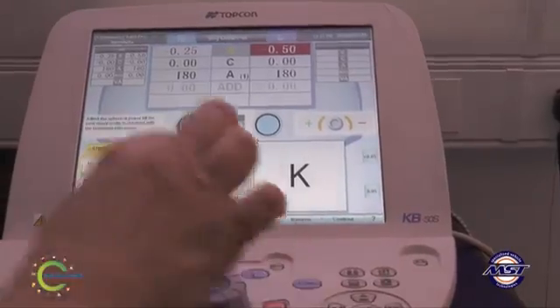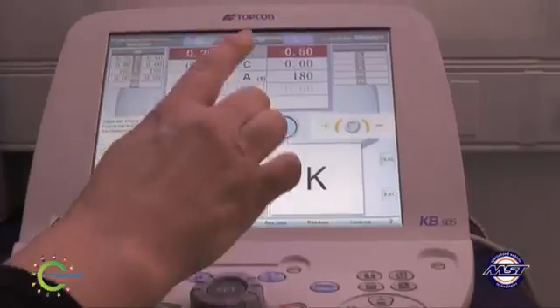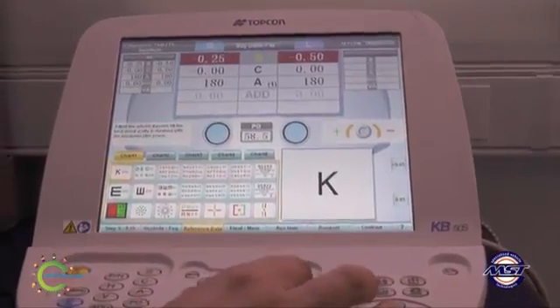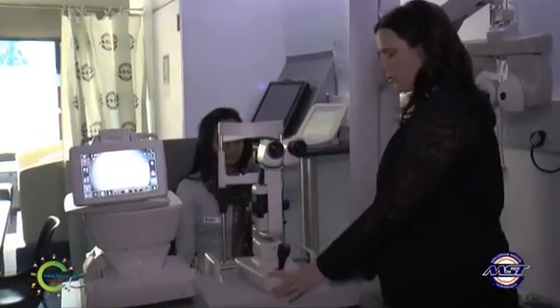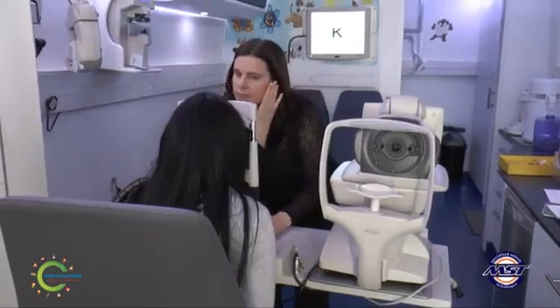Once you are happy with the phoropter readings, press the Print button, which will automatically update the MDR software and the phoropter readings, which will be imported later into the database. Once the objective and subjective reading have been completed, you can now use the slit lamp located next to the autorefractor to view the structures of the eye as well as the ophthalmoscope.